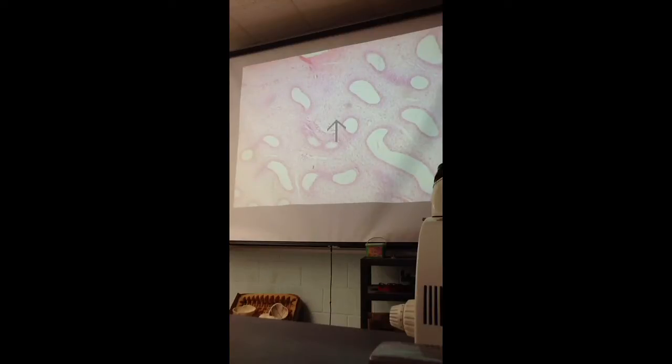Section taken through immature testis. You don't see any of the sperms or spermatogenesis, but you see lots and lots of connective tissue around. Immature testis. No active division, so no spermatocytes or spermatids or sperms. Immature testis.